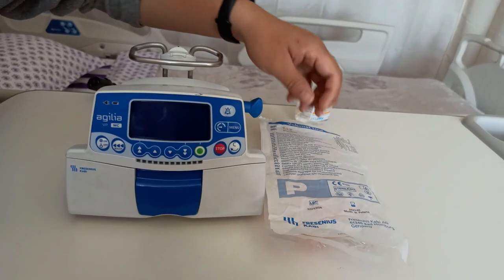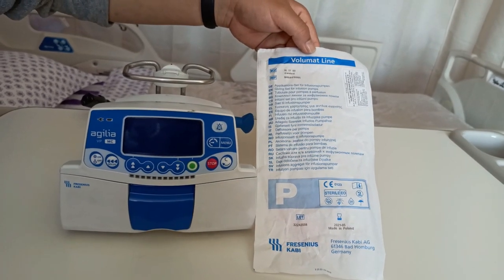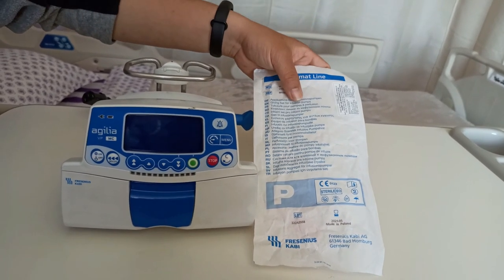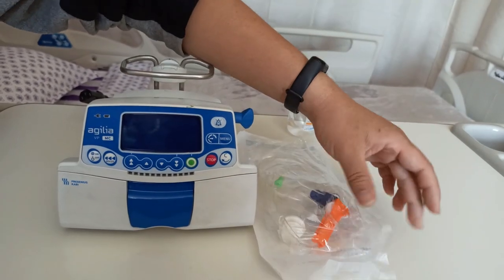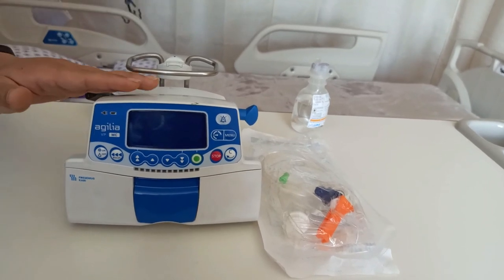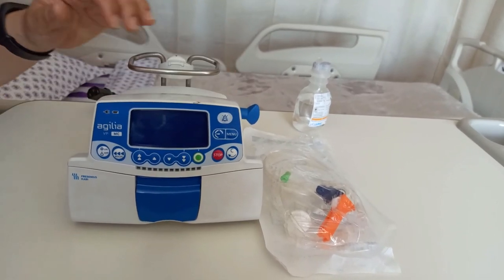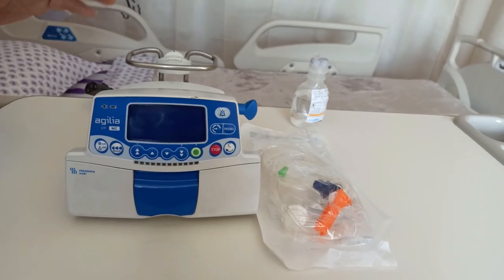We'll take a look at the infusion line. This line is called the Volumat line, and it is the only compatible infusion line that will work on this infusion pump. Please make sure you remember to indent this particular IV set when using this particular infusion pump.